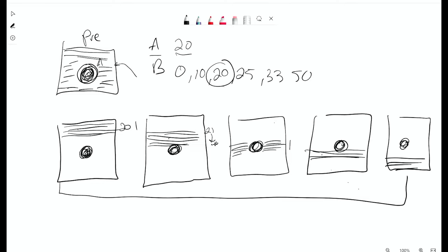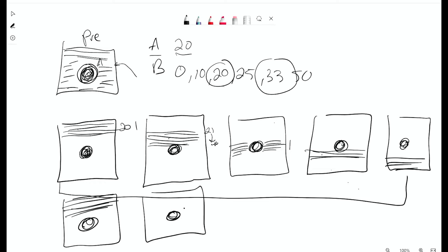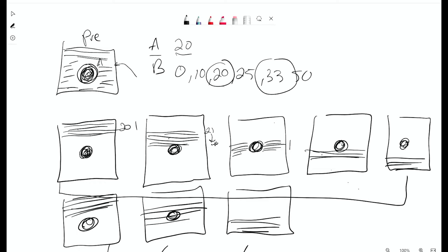For sure. Meanwhile, if I did the same thing, but I chose 33, that means that I would fill the center and I would fill 33% of K-space. Center, the next 33%. And so in this case, my temporal footprint would only be three phases instead of five. So that's the relationship there, because it's obviously going to take a longer time to fill 33% of the periphery than 10 or 20 or whatever. If I hit zero, that's going to take me back to regular keyhole filling. Right. Make sense? For sure.